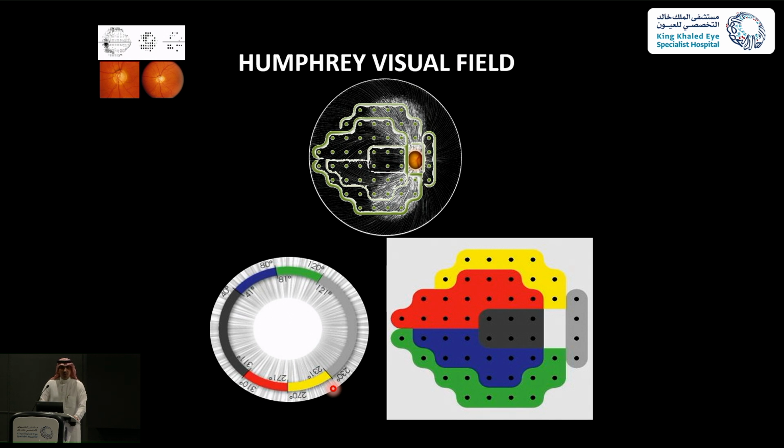As we used to mention to you before, and we mentioned today in the basic science course, that's the old Garway-Heath map, which has been modified several times by several researchers. The importance of this Garway-Heath map is that it will tell you, while examining the patient clinically, where the expected visual field change could happen in the future.